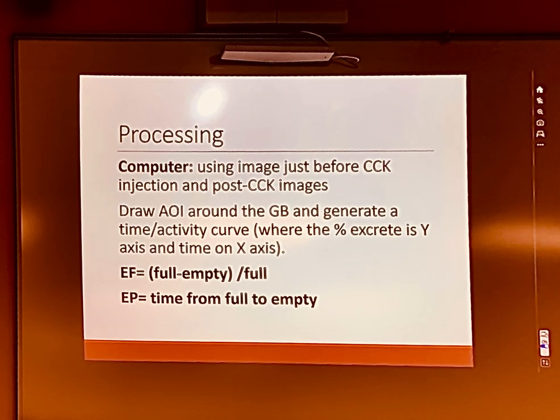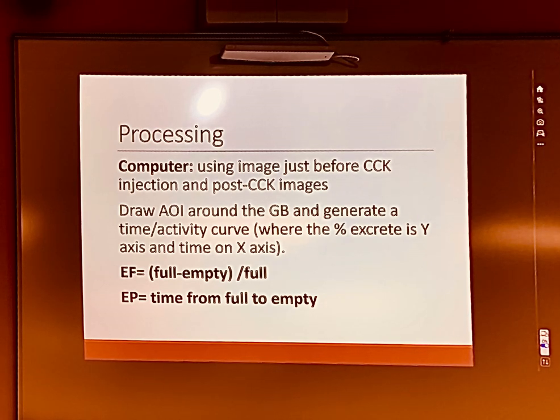Okay. Yeah, pre minus post divided by pre times 100. And luckily your computer will do this all for you because we love a good computer in nuclear medicine. Okay? But what happens if your patient moves?